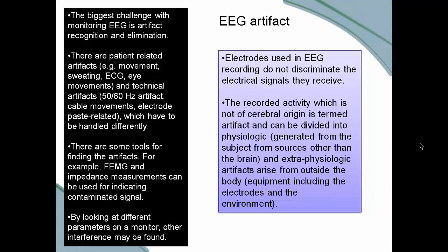Where else can you get noise? Given that you've got a millionth of a volt reference anyway, you can pick up more than that just on a wire with transient radio waves all around you. So it is very important to realize the ambient electromagnetic environment, and that is something that I've seen all too often.